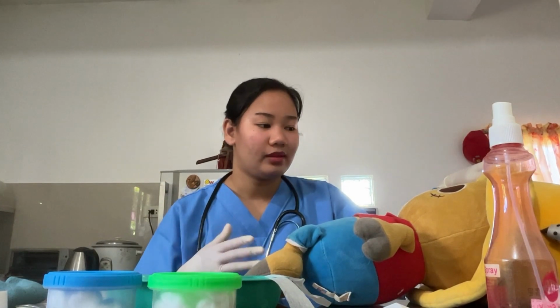So after checking the history and assessing the mental status of the patient, we will proceed to the identification of the patient. So let's assume that my patient is a woman. I will ask her to state her name and date of birth.